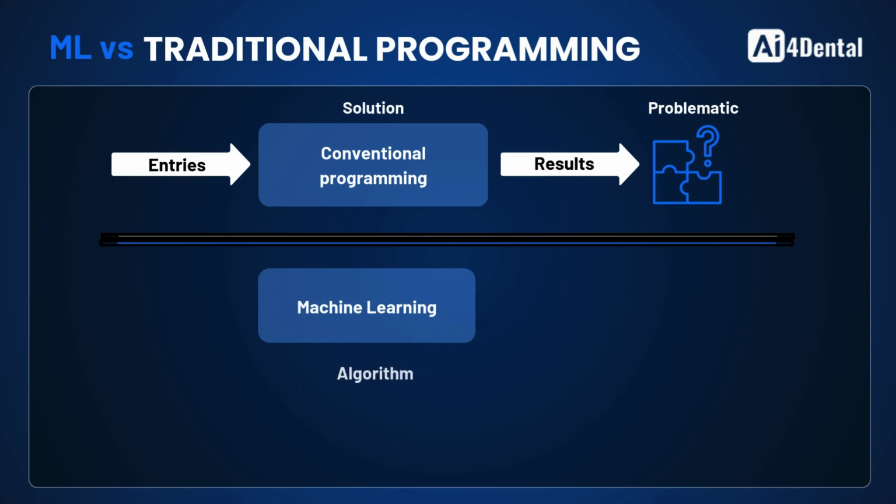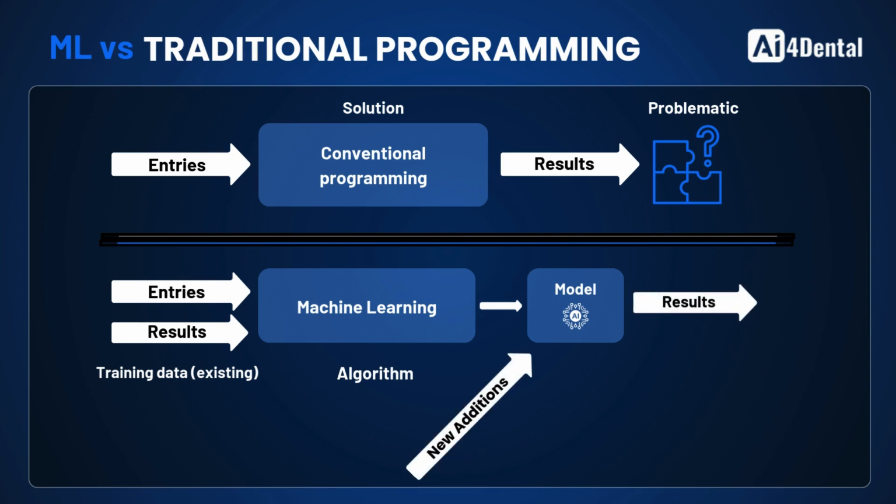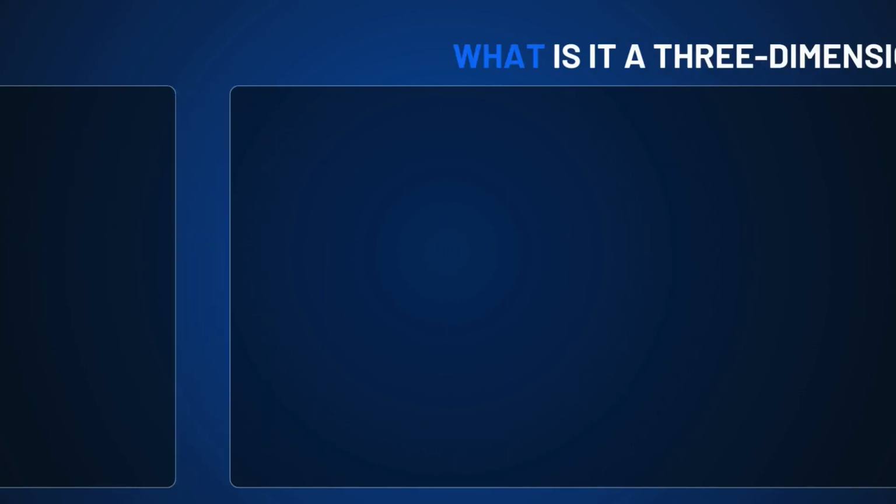Instead, an algorithm based on neural networks, somewhat like the human brain, is created to ingest input and output data and autonomously generate the expected results by configuring its networks correctly. Once trained, it can process new inputs to deliver results. This paradigm is incredibly powerful as it shifts from explicitly coding every solution to configuring systems that learn from existing cases. In dental workflows, these software tools work with 3D models.